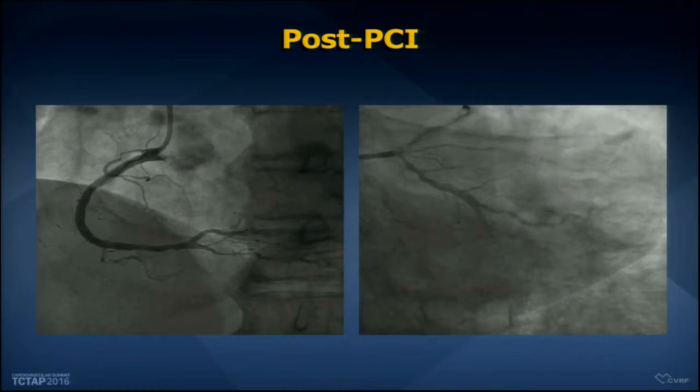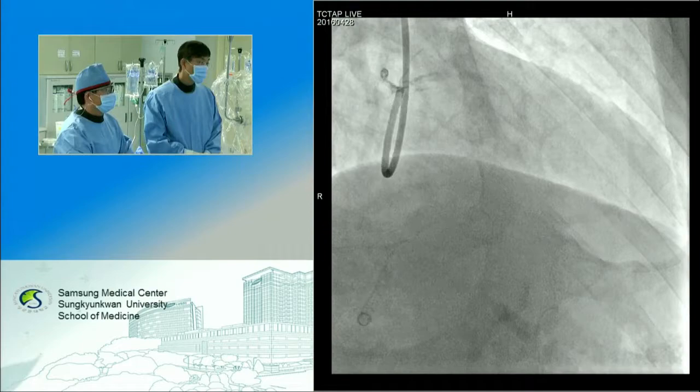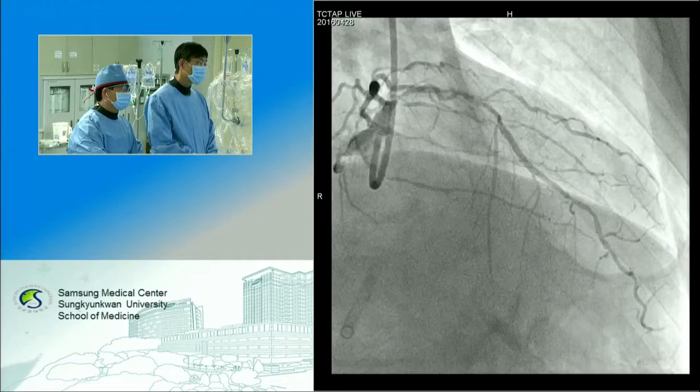Okay, I'd like to show today's angiogram. Angiogram on the screen, please. One quick question. What's the patient's creatinine? Today, this is our cranial view. You can see the calcification on each side of the coronary artery. That means we have severe calcification in diffuse disease.